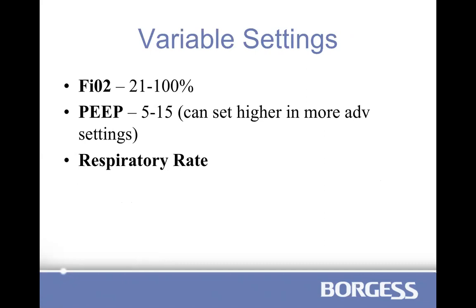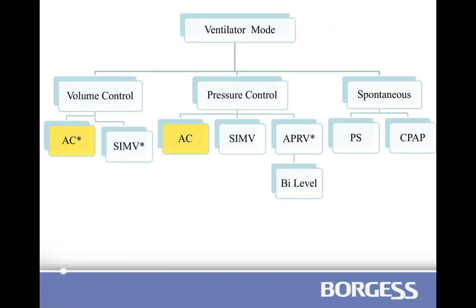Again, with the variable settings on either pressure or volume control, you can always adjust the oxygen, you can always adjust the PEEP, and you can always adjust the rate. Okay? That is regardless of how you set the breath delivery.